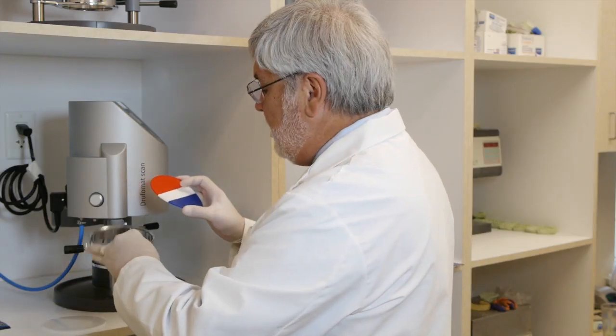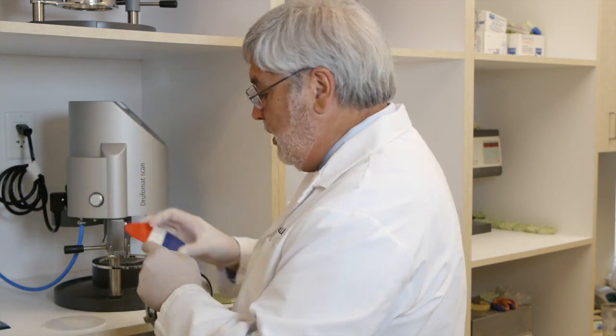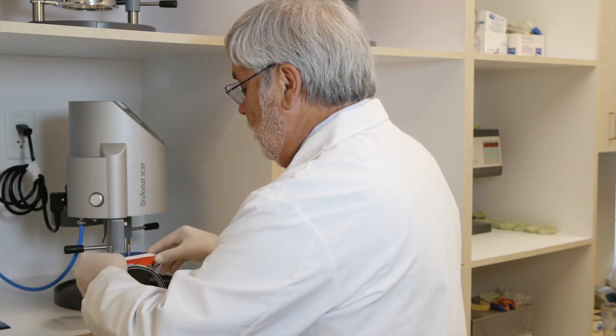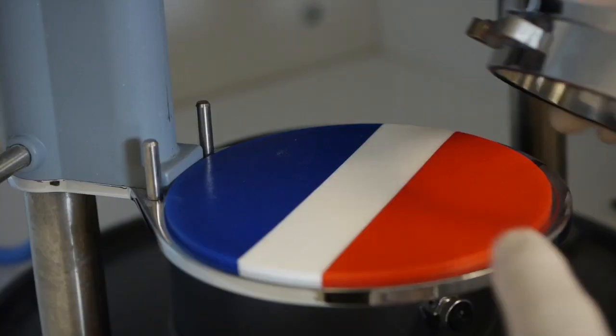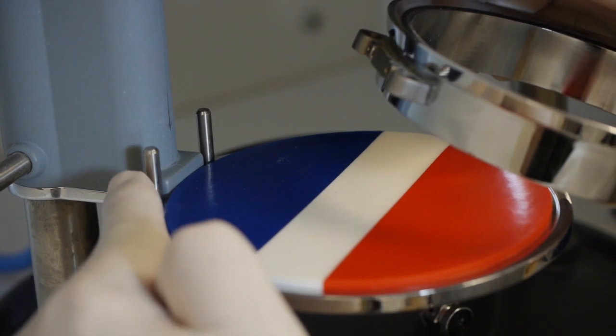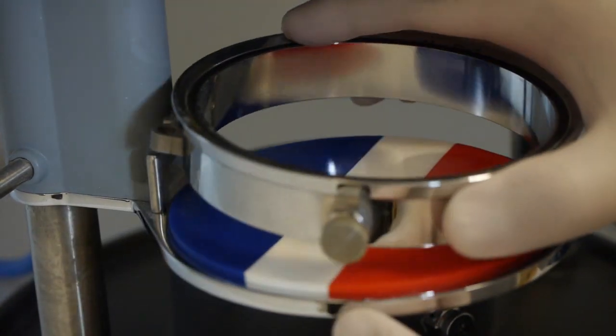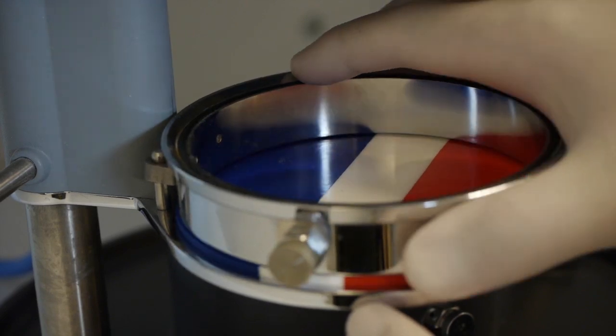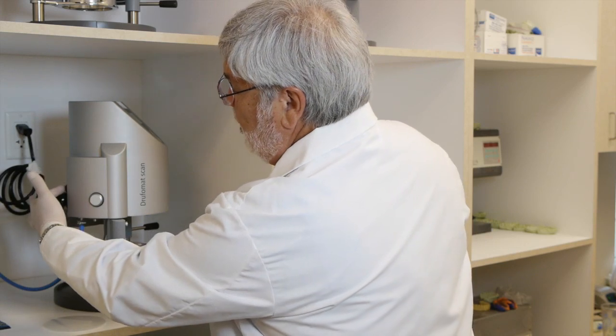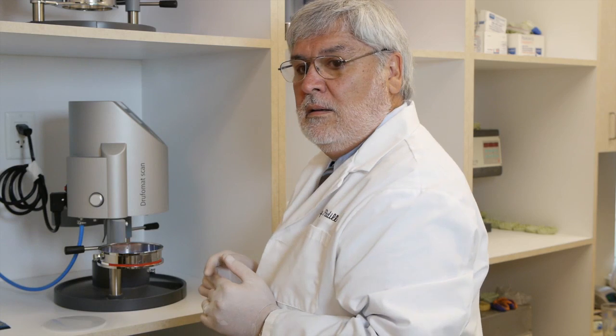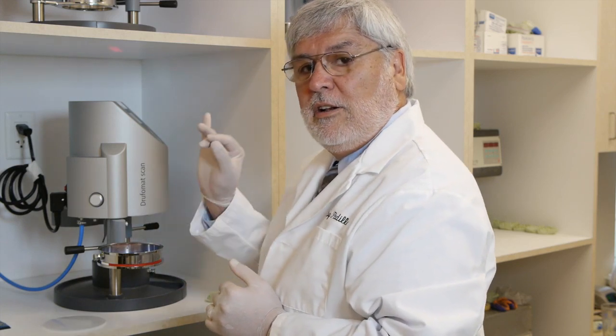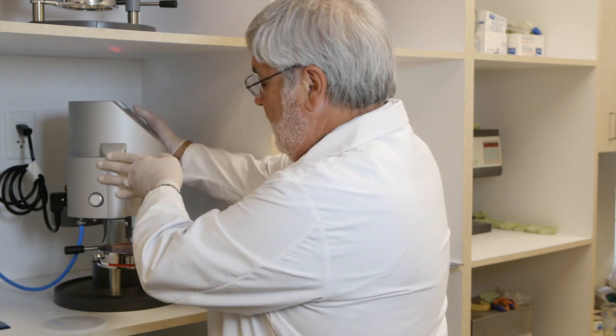First thing we do is place the mouth guard material in the ring. These two holes you see right here must fit in these two posts. Now we have to turn the machine on, so we'll turn the machine on from the back. You'll hear a little beep - that means the machine is on.